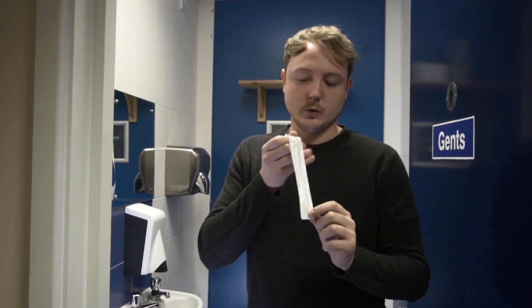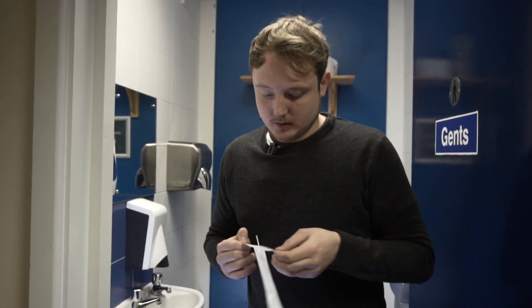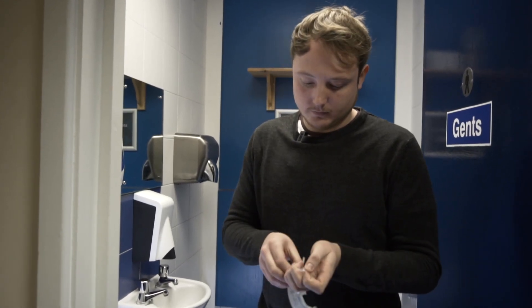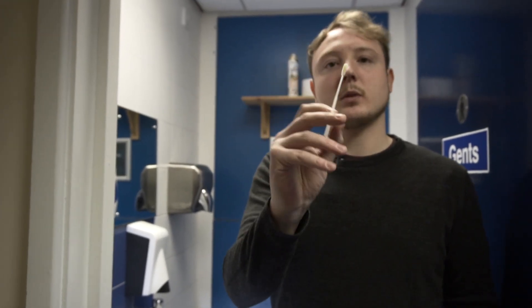So as I said, we're now going to be doing the biofilm test. This uses a small swab, which we will see here. What we're going to do is put that swab where it is we want to test. Ideally you want to be looking at somewhere with 10 centimetres squared. Right now we're going to be using the taps.